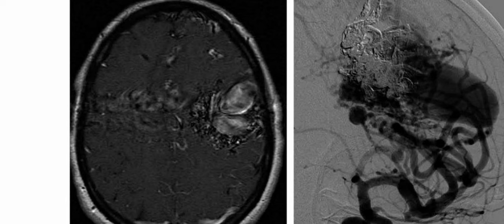So the key finding here is that there is a parenchymal mass with a vascular nidus and enlarged feeding and draining vessels. So this is a very typical picture of arteriovenous malformation, and this is a diagnosed case of arteriovenous malformation.